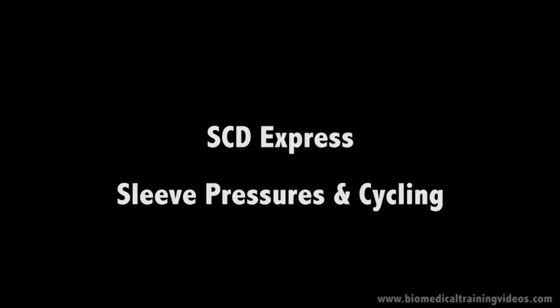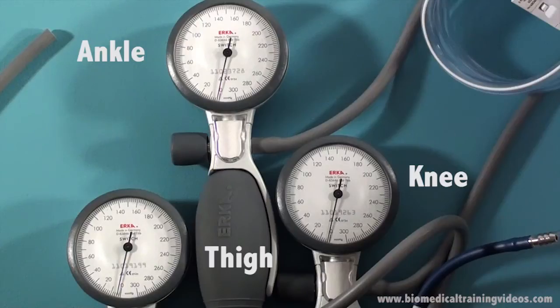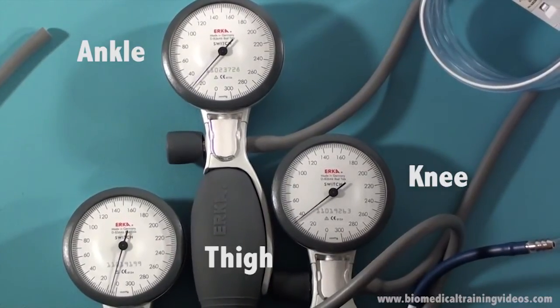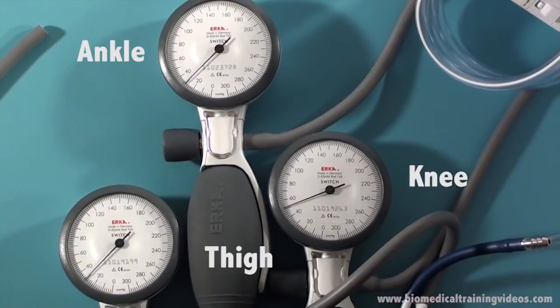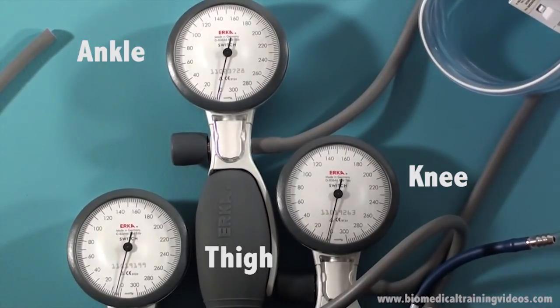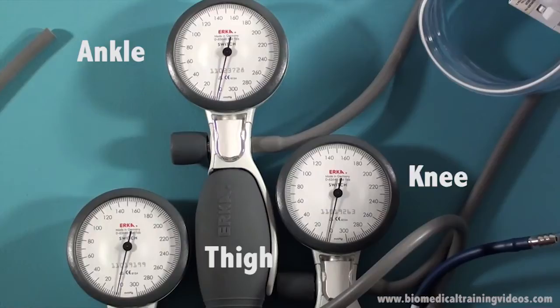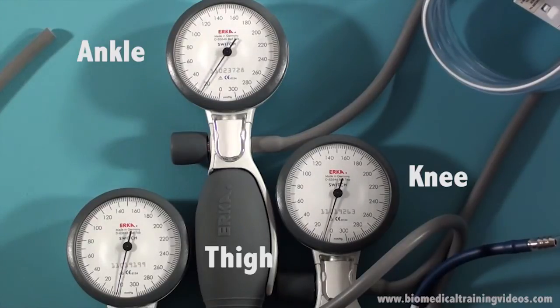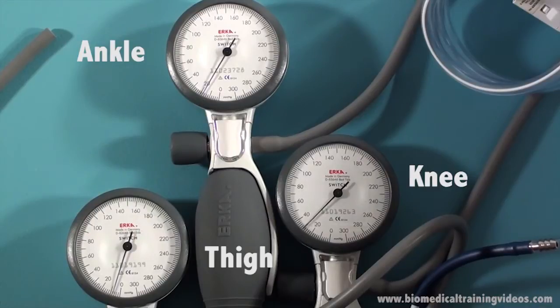I will now demonstrate the pressures and the cycling. I have set up 3mm tees into each of the 3 cuffs in the leg sleeve to try and show the cycling. As you can see, the ankle, then the knee, then the thigh is inflated to around 45mmHg. It's a little hard to demonstrate, but you get the general idea if you look at the cycling.